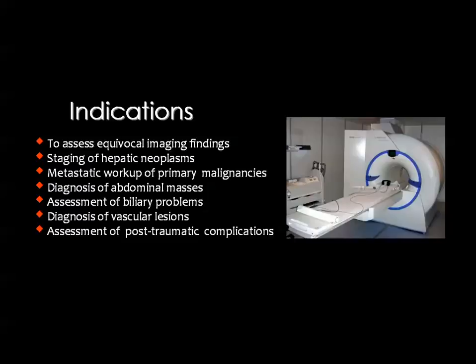As you all know, I have little experience in ultrasound imaging, so I cannot explain in detail the value of ultrasound, but I can show some examples whenever the ultrasound is good and relevant. The indications for examination of the abdomen by CT include so many items, and the first and most important one, in my opinion, is to assess an equivocal imaging finding.